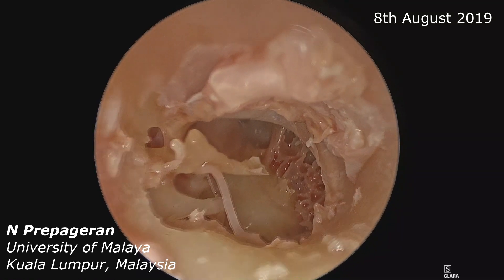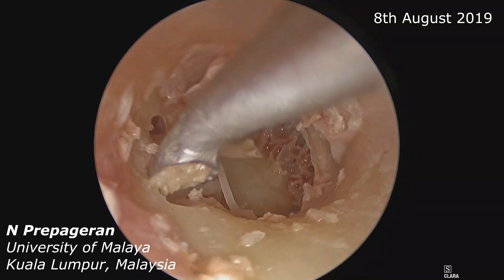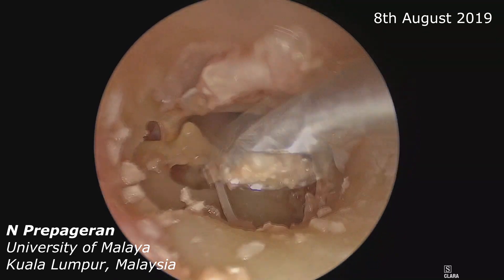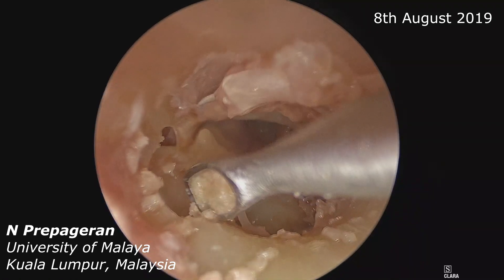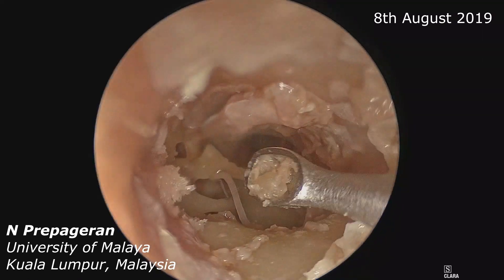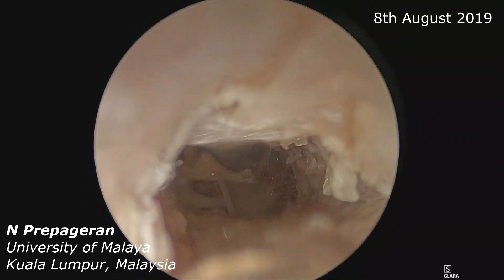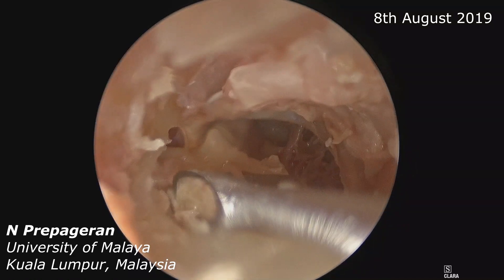That's what the endoscope will take away from you — you will not get the 3D dimension that you get with a microscopic view. So sometimes you can easily accidentally injure structures. Knowing how hard this specimen was for endoscopic skull base, I'm quite sure it won't be easy to curette. But this is how we curette and drill.